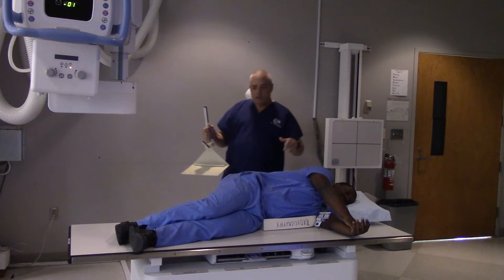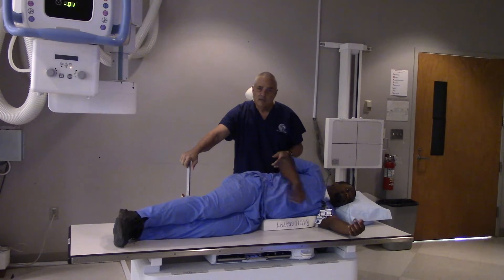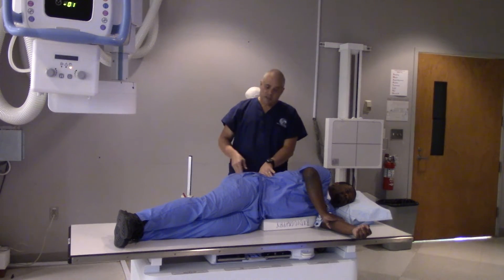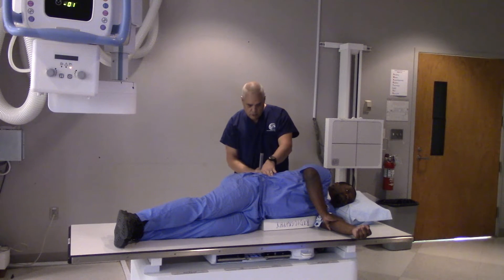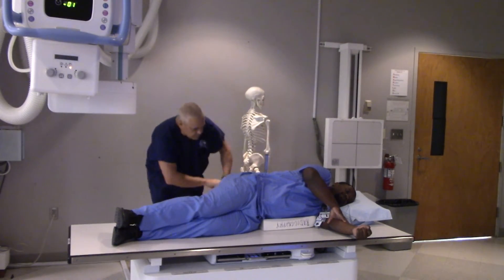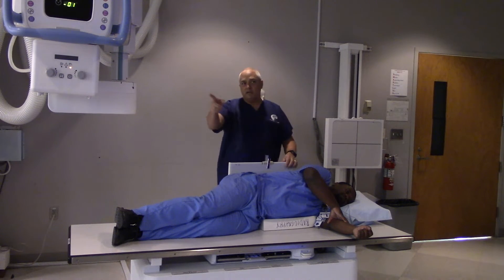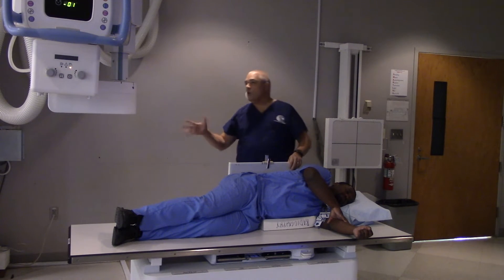Where am I supposed to be aiming? Where's my central ray location going to be? Two inches above the iliac crest. There you go. We know from previous experience that Mr. Lee's three fingers make two inches, so that's about where I'm going to be aiming — two inches above the crest. That'll help me get my equipment situated, and I can fine-tune if I need to. If the top of my image receptor is about even with the patient's axilla — their armpit — then I know I'm going to be in the ballpark.